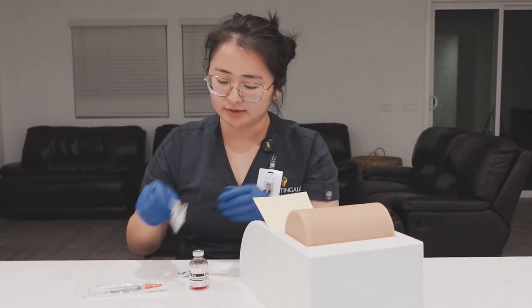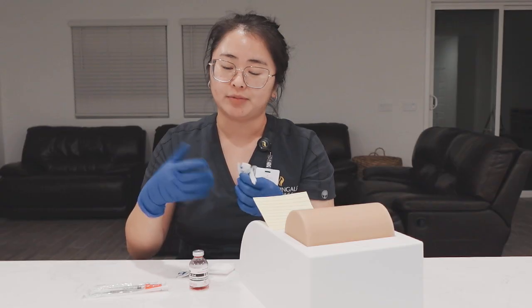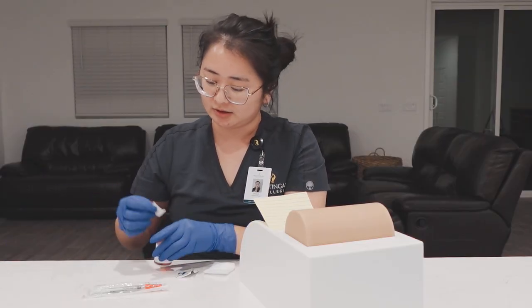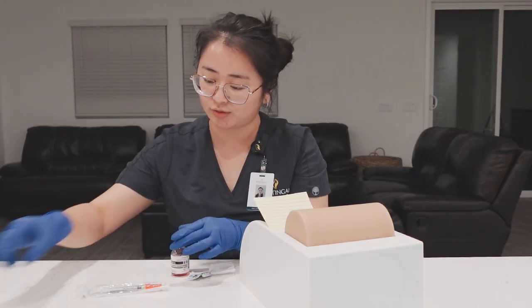Okay, so I'm going to use an alcohol prep pad. Now these are open due to practice, but in the real world, we would not use an open supply. Okay, we're going to dispose of that in the trash. We're going to wipe the top of our vial. We're going to let that dry.